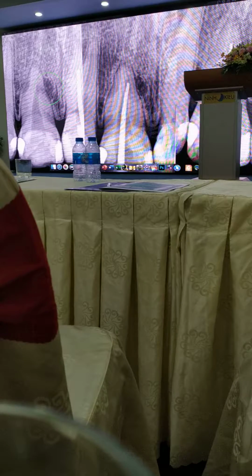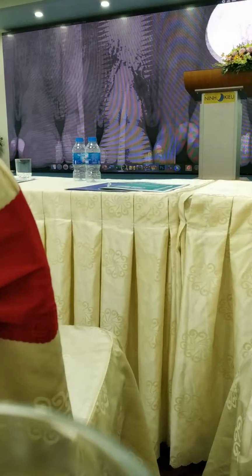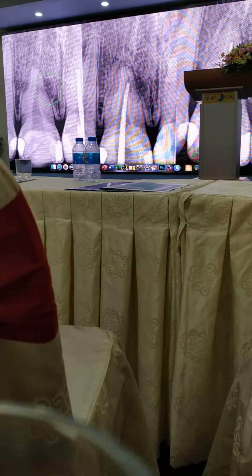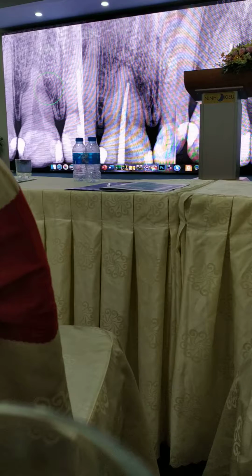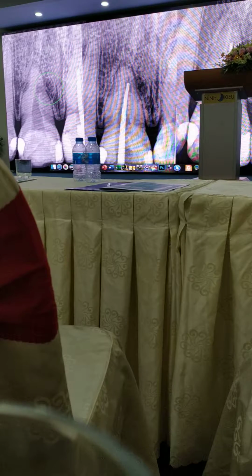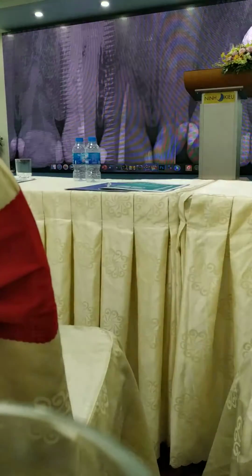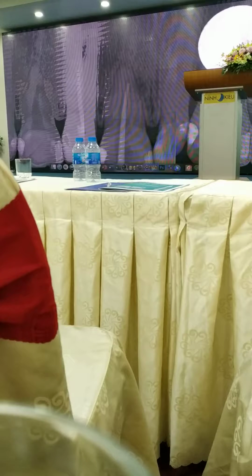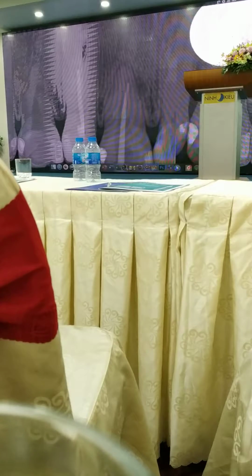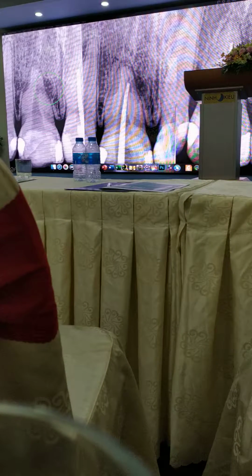I will place my obturation to this level, wait for 3 days, and then go inside following the gutta-percha master cone, expecting that these sealers will block this entrance and allow me to go all along the main root canal.